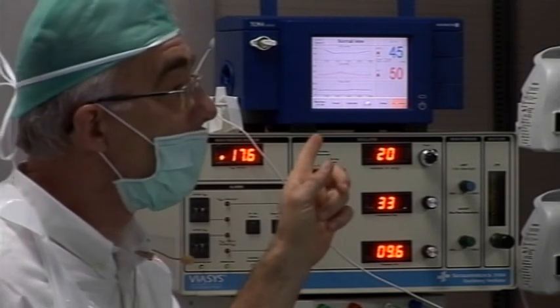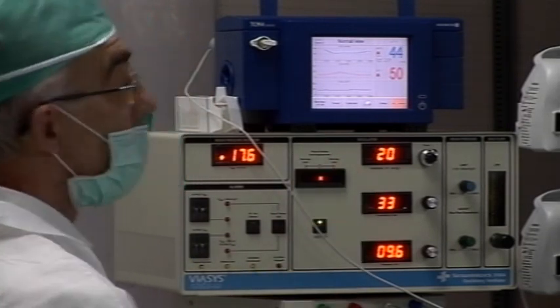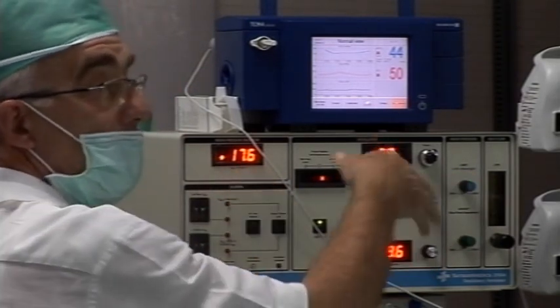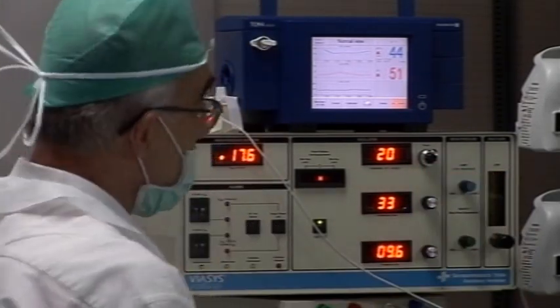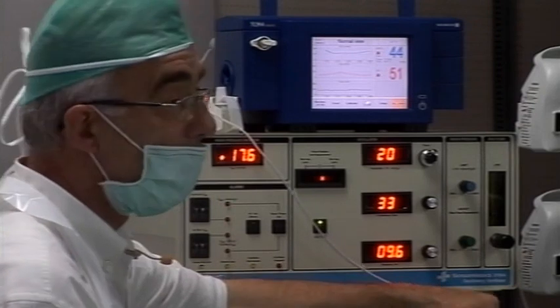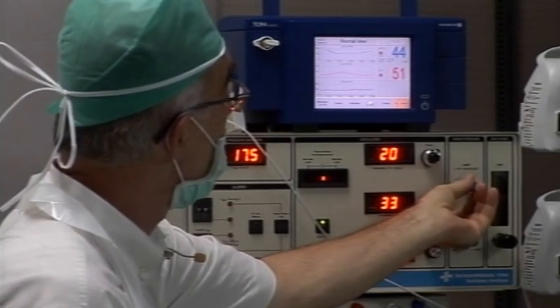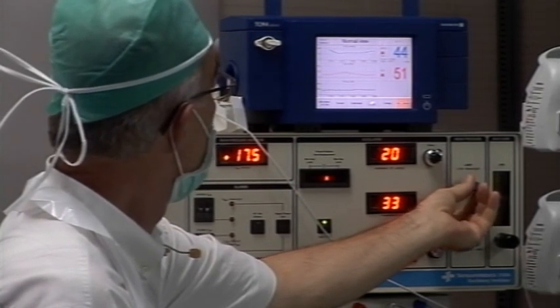Now, we will see how the active alarm works. This button here, that is my optimal CDP. I will stay there for a while, so I want to have an active alarm. So I decrease the volume of the balloon there, and by turning to the left slowly.